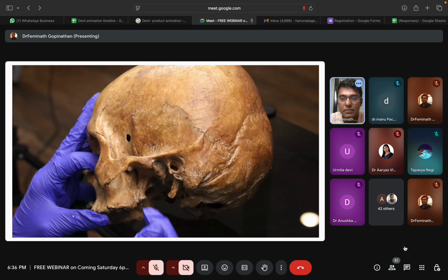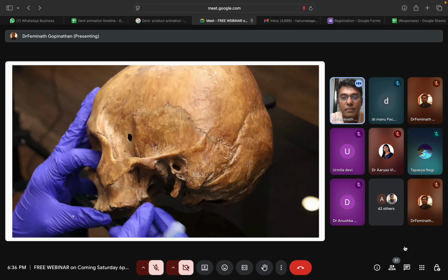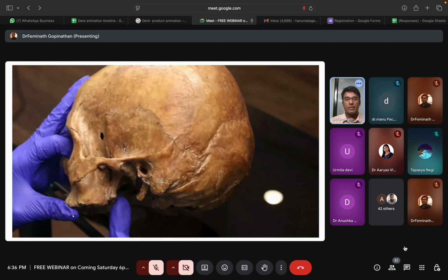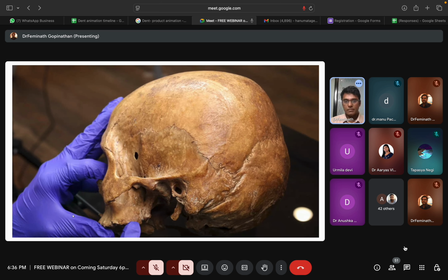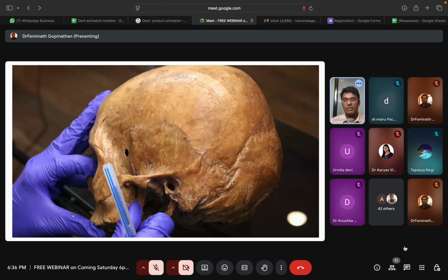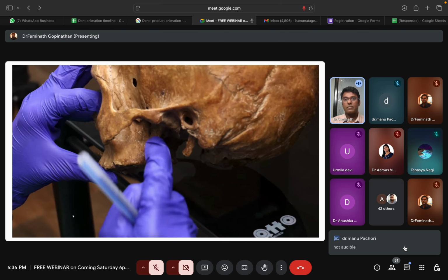In case of pterygoid implant placement, we have to know where it has to be placed properly. In this slide, we can see this is the lateral pterygoid plate and this is the medial pterygoid plate. Pterygoid implants are directed from the tuberosity region, then angle backward, engaging the pterygoid process of the sphenoid bone, which is a safe area where no blood vessels are found and all the muscles are attached to the lateral pterygoid plate.